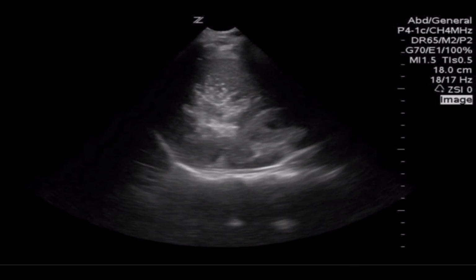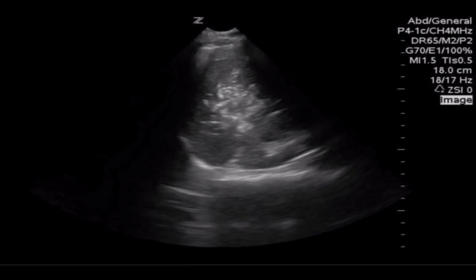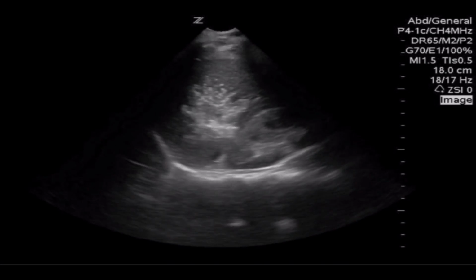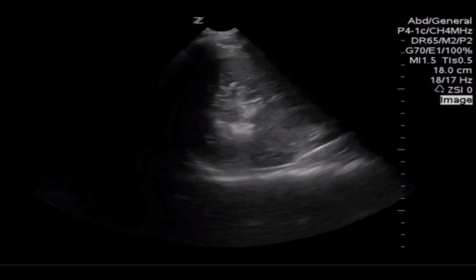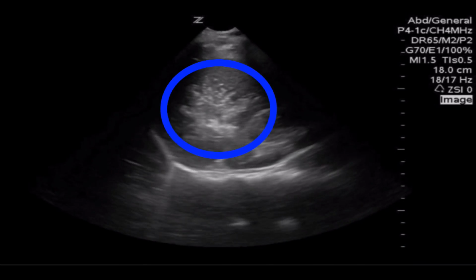You got a trauma patient coming in, multiple gunshot wounds. You do a FAST. I'm going to skip the cardiac portion, which was negative for pericardial fluid. But in the right upper quadrant, we see this, which demonstrates not a clear pocket of free fluid, but there is this very hyperechoic portion within the middle of the liver.